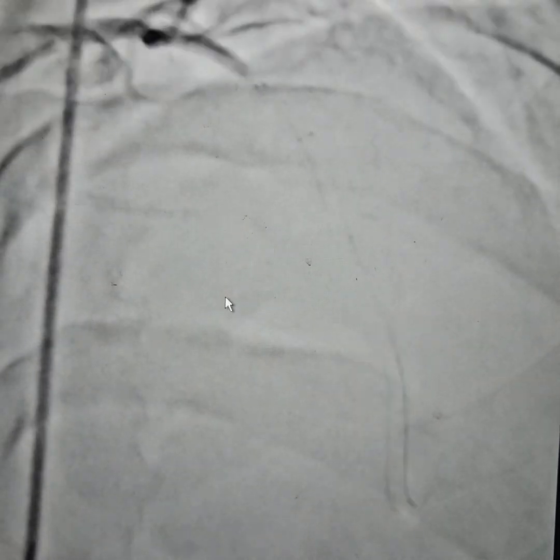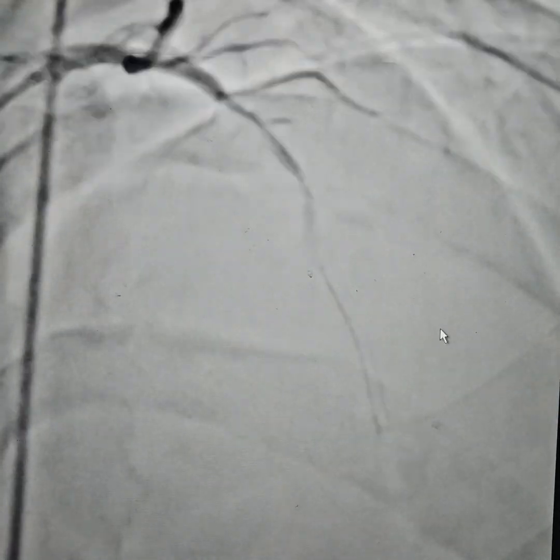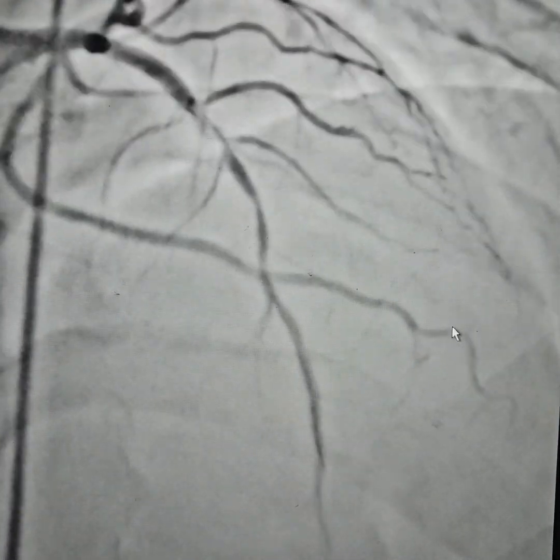We are doing further predilatation with a 2.25 mm balloon. You can see that the artery has opened up quite nicely. This is after some nitroglycerin that we have given.